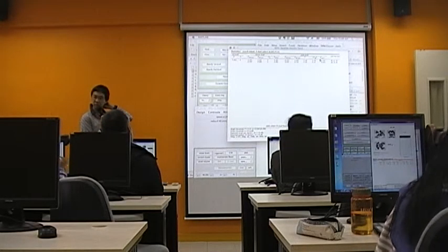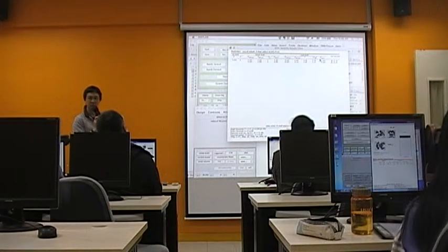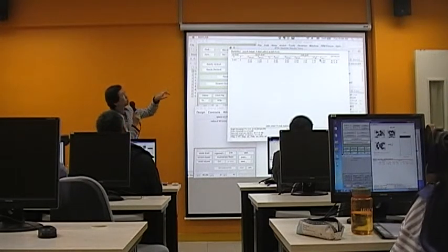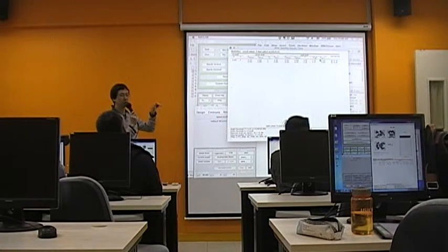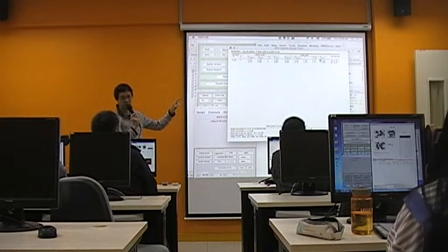Since we have this kind of small volume correction, we also have to report this at the same time. Because we need to correct for multiple comparisons, the uncorrected p-value is not very useful.